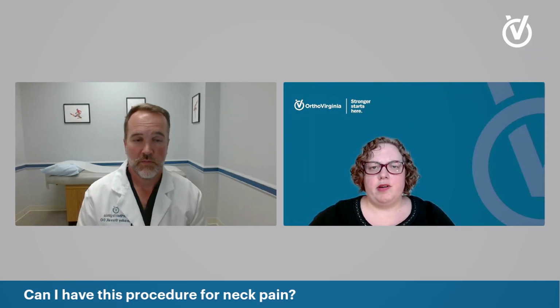Thank you. Our next question is, can I have this procedure for neck pain? So the procedure is FDA approved for treating the L3 vertebral body down to the first sacral vertebral body, or the S1. So L3 through S1 are the levels that are approved to treat. And there's currently no approach to get into the neck for that, and it's not approved for use in the thoracic spine. So really, this is a treatment for chronic lower back pain currently. There may be down the road some iterations for treatment of the mid back pain, but right now, the only treatment availability is for L3 through S1.